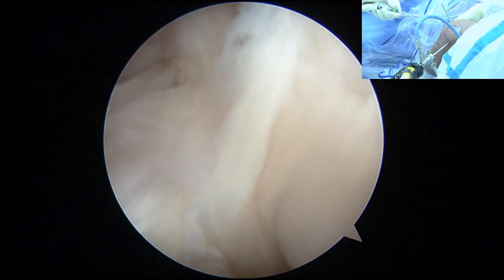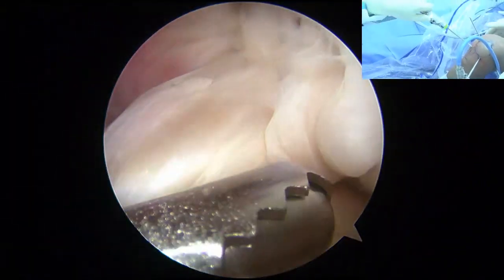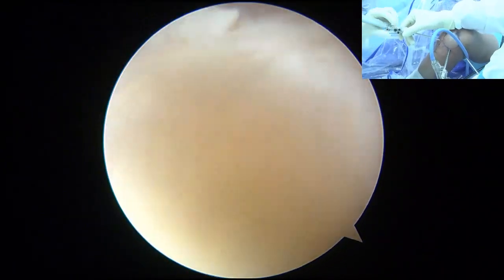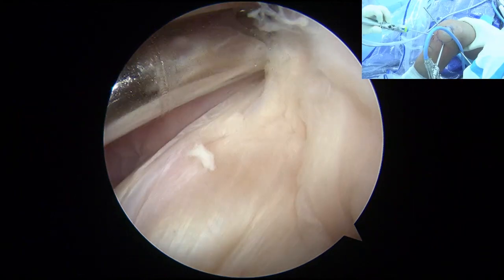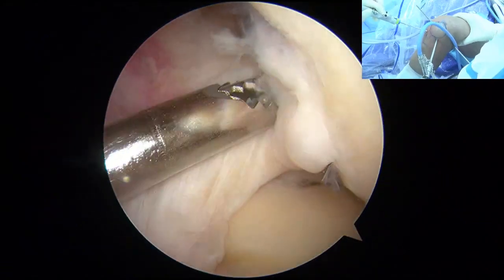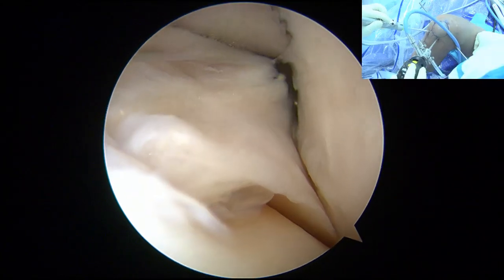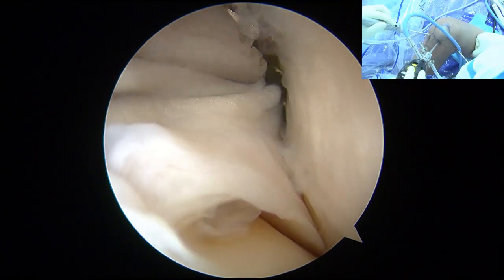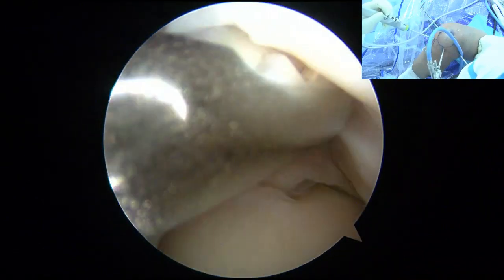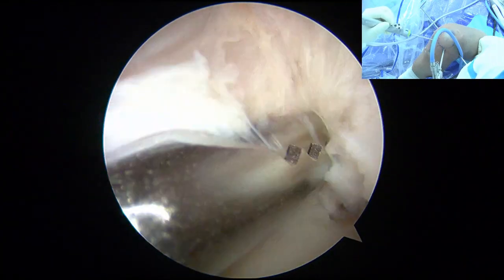Okay. So next step is to identify the ACL footprint, right? 接下来我们找 ACL 的足印。So this is ACL. ACL have two bundles, right? ACL 已经看到了，它分两束。This is the AM and PL, right? 前内和外束。The attachment is lower. You look at the ACL attachment, actually it's quite low. 它指点其实比较低。I check this out by shaver, and then you can see better, okay?